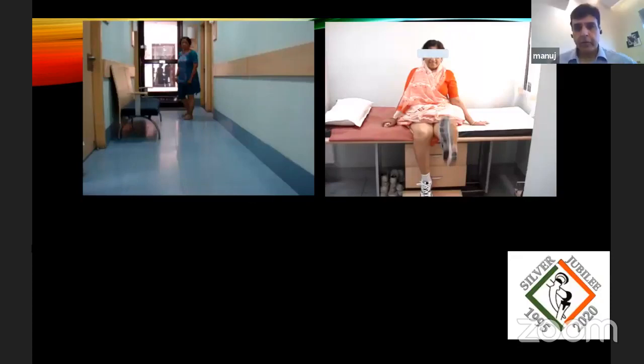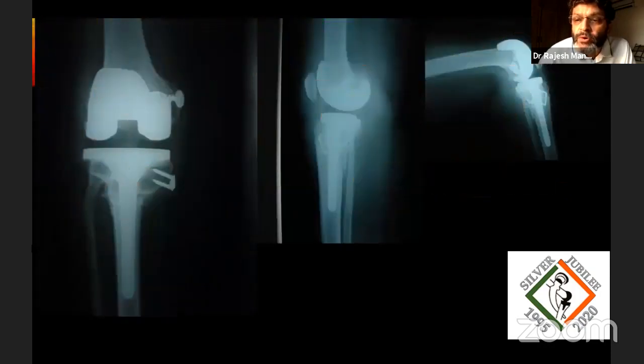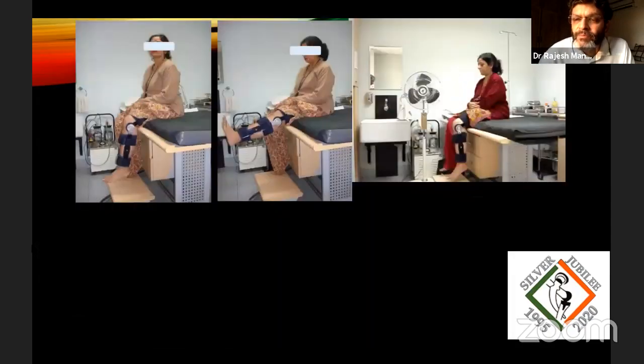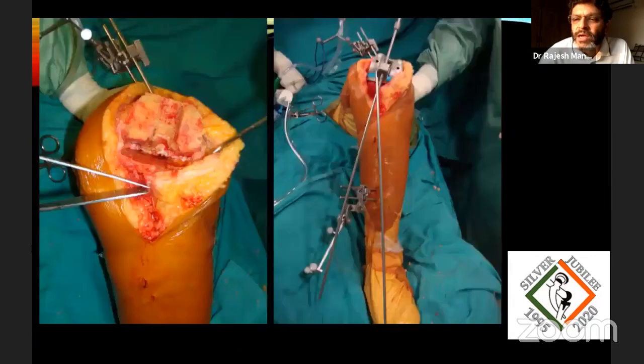So any questions from the panelists? Yeah, Rajesh. Rajiv, great work. I want to ask you that this particular case probably had a little extra valgus on the osteotomy site, and therefore you needed to do the osteotomy on the tibia. But otherwise, in normal high tibial osteotomies, would you need to do an osteotomy like that, or can you just correct it?